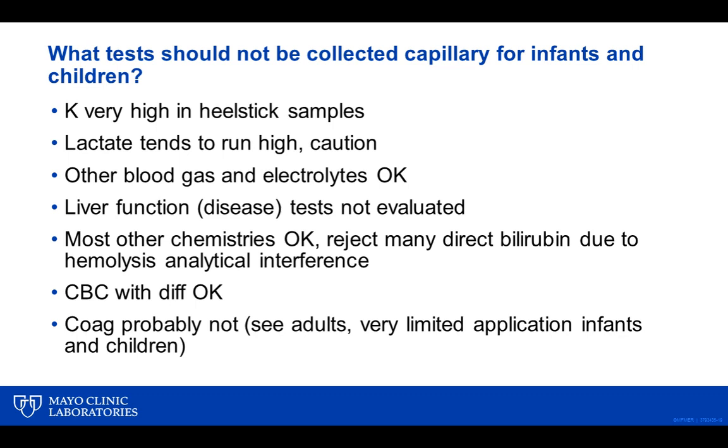Lactate and ammonia would be problematic. Lactate would tend to run higher and be difficult to handle appropriately in terms of getting into the right preservative, the gray top tube for the lactate. For ammonia, we need to cool that and get it to the lab very quickly to prevent false increases, so those would be problematic. Otherwise, biochemical testing works pretty well.